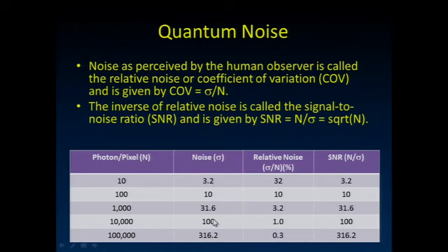which is this noise number divided by the number of photons, n. So this 100 divided by the 10,000, here expressed as a percentage: 100 divided by 10,000 times 100 to get it in a percentage. The relative noise here is 1% compared to the relative noise down here, which is 32%. So that's the number that we perceive when we visually look at the image.